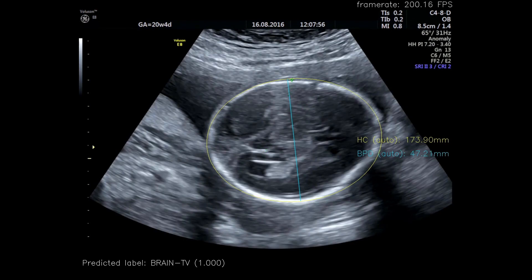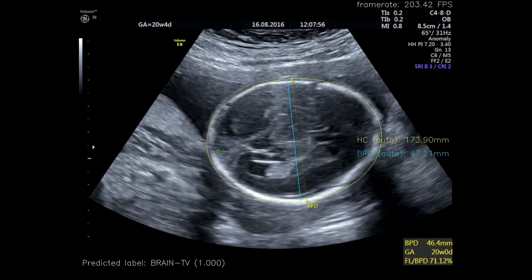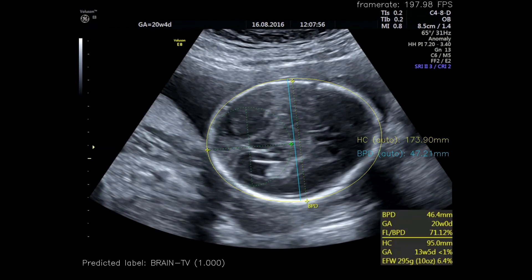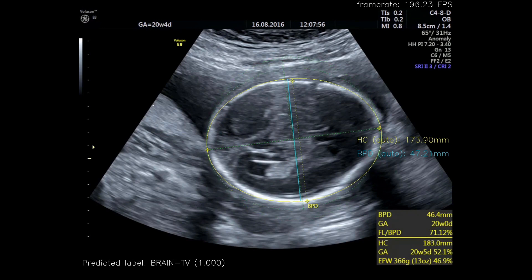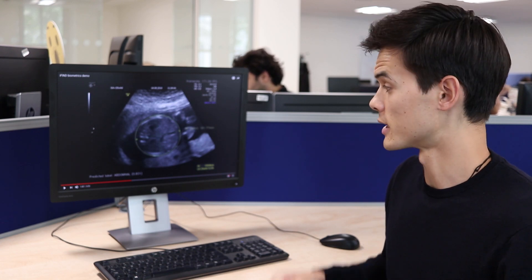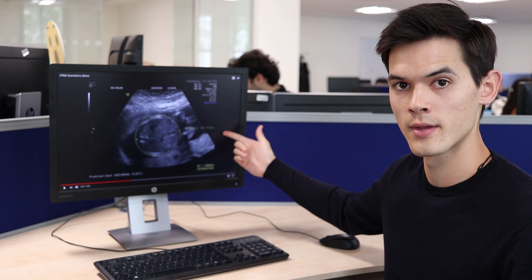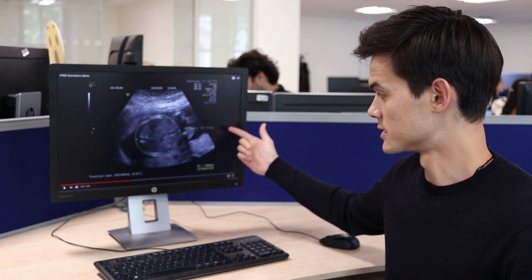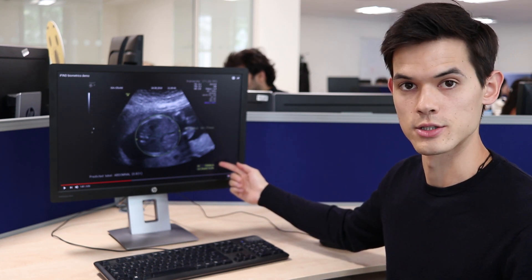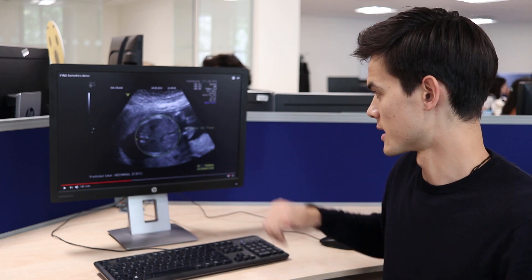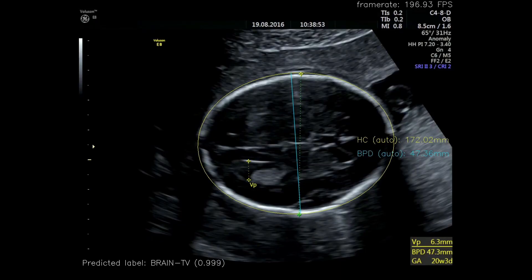In this image we can see a green dotted line which the sonographer has drawn and is adjusting in order to make their measurement. Superimposed on that is a yellow line which is determined automatically from the biometrics model. We can see the automatic measurement made here and the measurement being made by the sonographer, and they're within about 2% of one another.